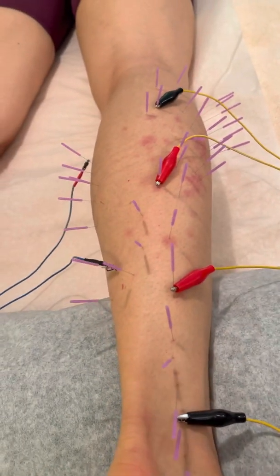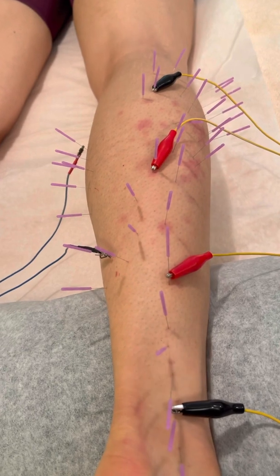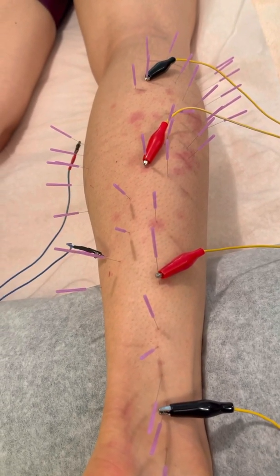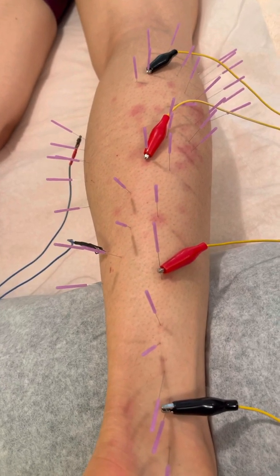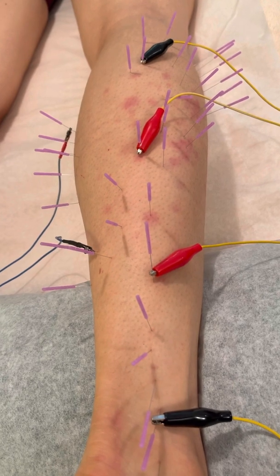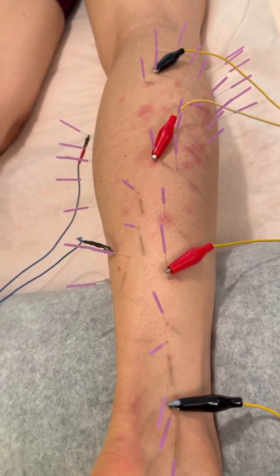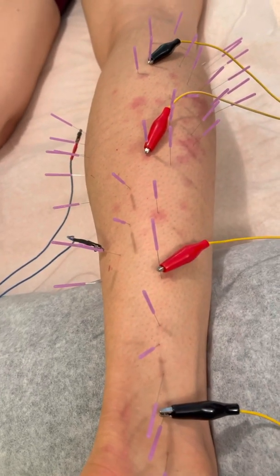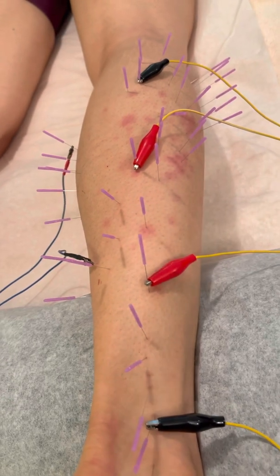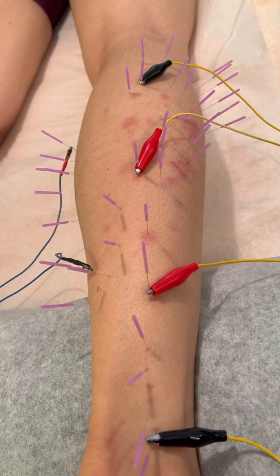So I'm going to end this now. This is how you combine electrical stim with dry needling to get a stronger release of the muscles in people that need it and tolerate it. The people that need it are people with really tight muscles that are very strong. And again, they have to tolerate it. So you'll notice when it got really strong, she laughed. Well, some people would freak out. So you have to be very careful about adjusting the treatment to the tolerance level of the individual.